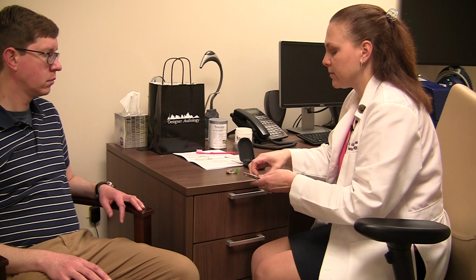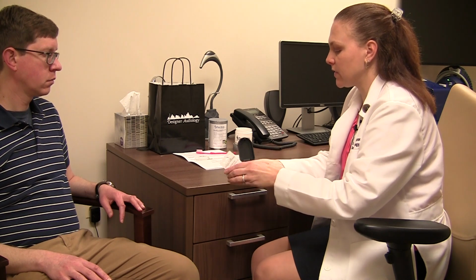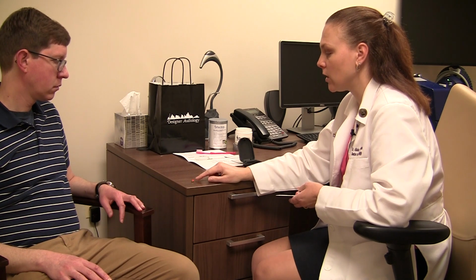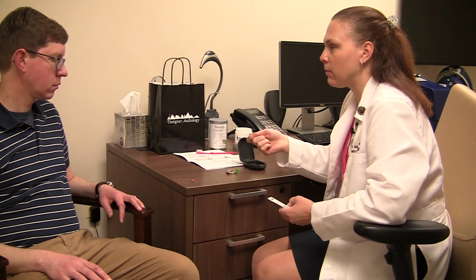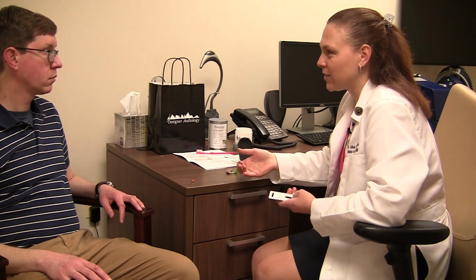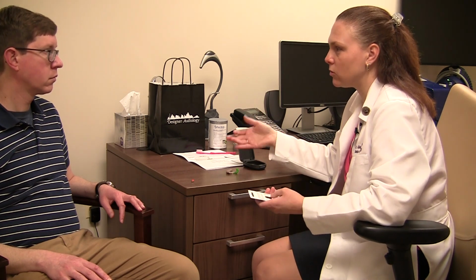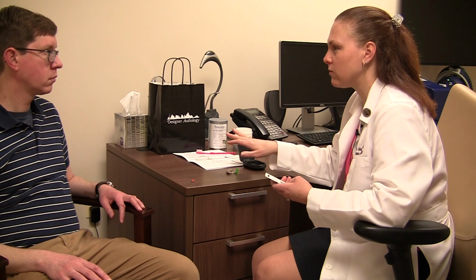All the batteries themselves have these little stickers on them, which is how you know they're size 13 because they're orange. That sticker is actually keeping that battery from depleting. So don't take the sticker off until you're ready to use it. You don't have to do anything special if you buy in bulk or if we ship you batteries through the club and you have 3 extra packs, just leave them alone. Don't take the sticker off until you're ready to use them.